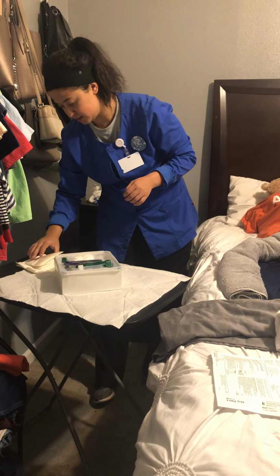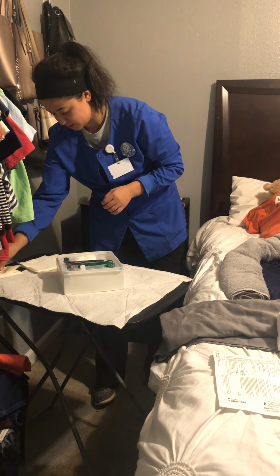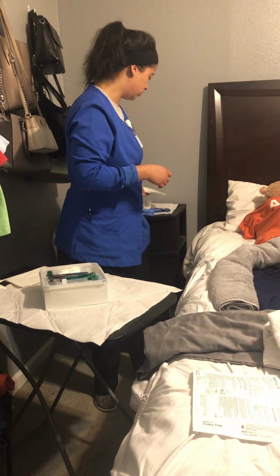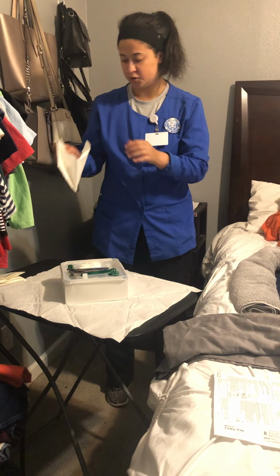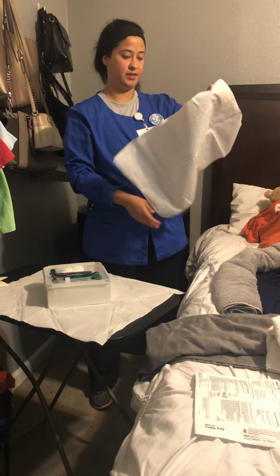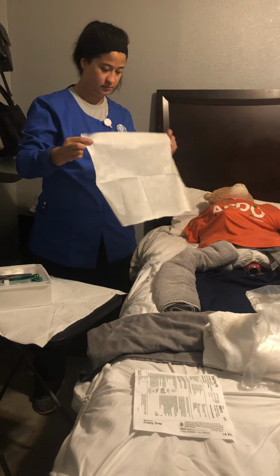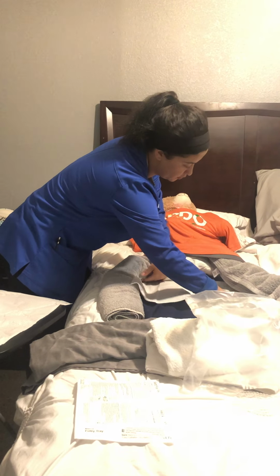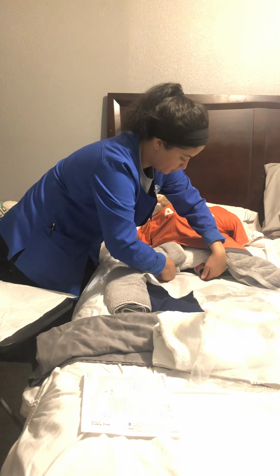Once I do that, I have my sterile gloves. I'm going to disregard the triangle one, and I'm going to place this absorption pad shiny side down on my patient. Again, I just ask her to lift her legs, lift her hips.